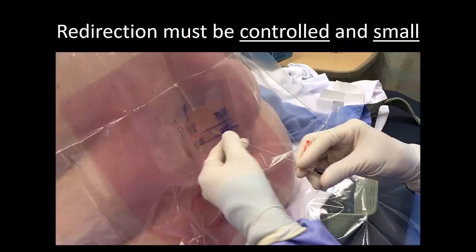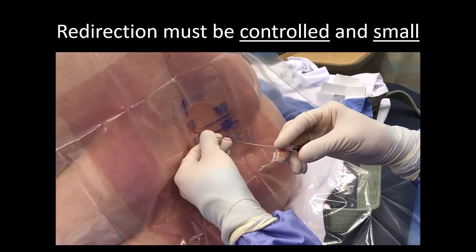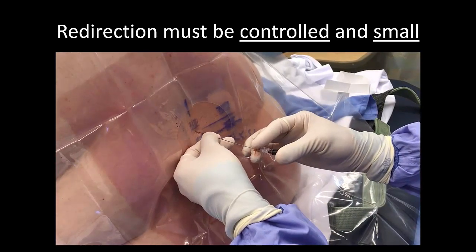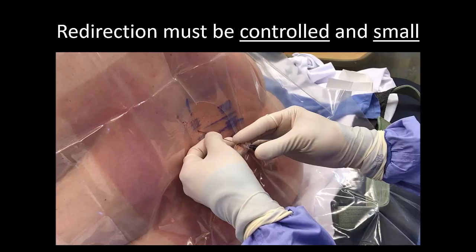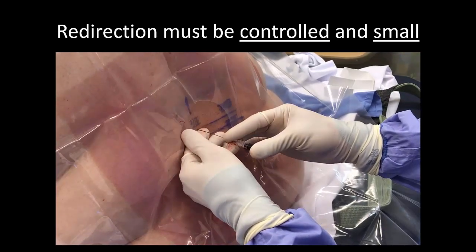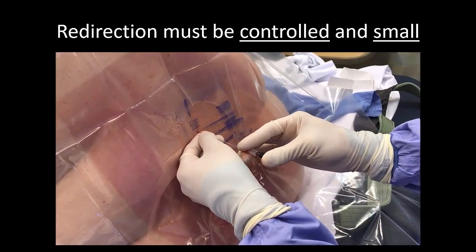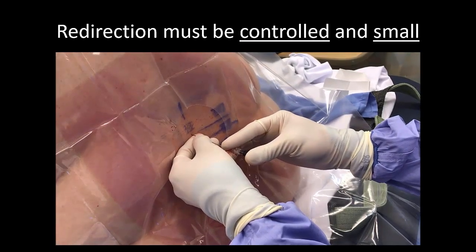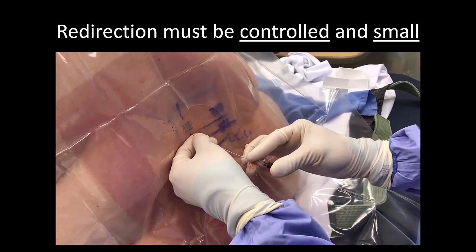To recap, use both hands to hold the needle and keep it straight at all times. Insert the needle in small incremental motions for maximum control and feel. If bone is contacted, withdraw the needle into the superficial tissues and make small adjustments in trajectory angle using the supporting hand as a fulcrum to control those changes in trajectory angle.